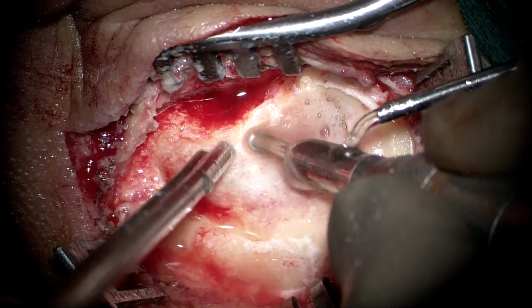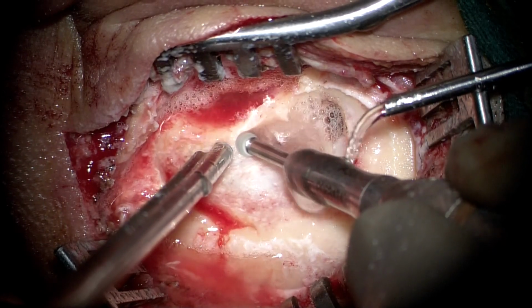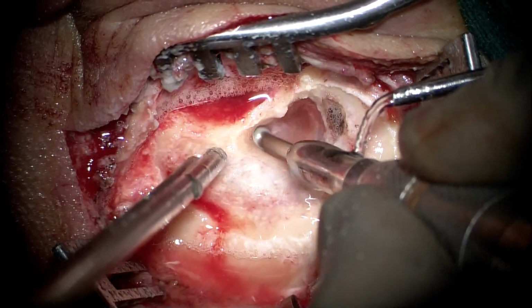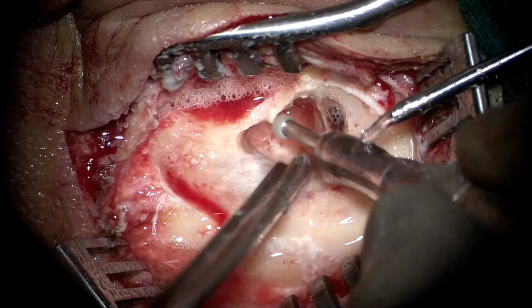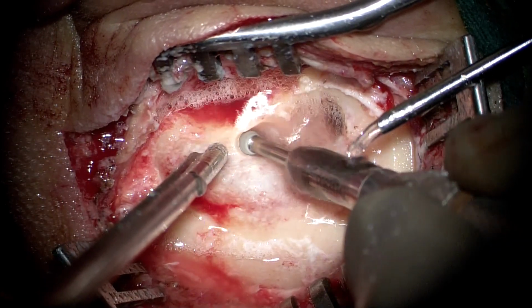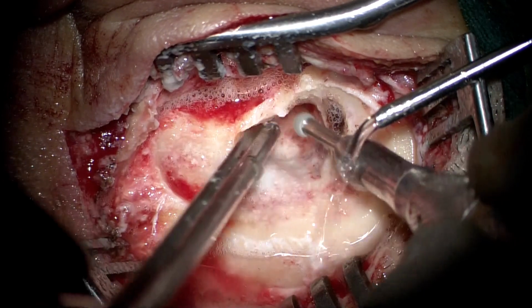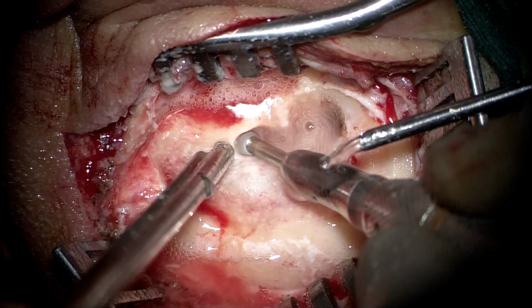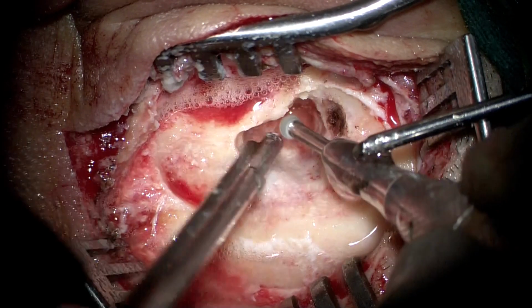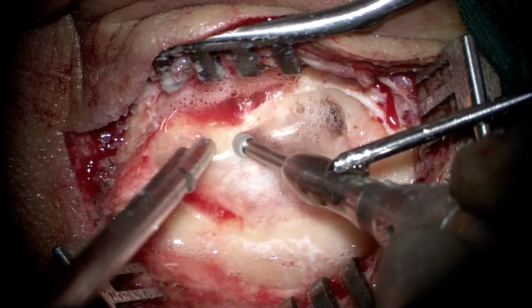One must keep in mind, this is an ablative surgery. This is not just merely partial drilling of one or two semicircular canals. All three semicircular canals have to be completely drilled down, and the vestibule has to be opened, along with removal of the membranous labyrinth in the vestibule, namely the saccular and the utricular end organs, so that this patient cannot have any further episodes of vertigo of the Meniere's that they normally have.